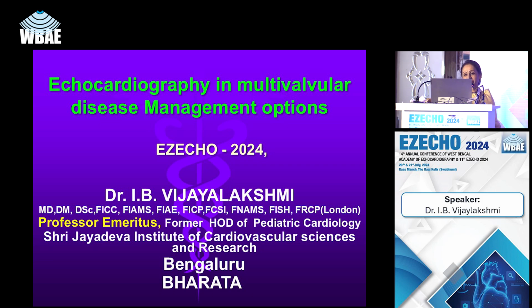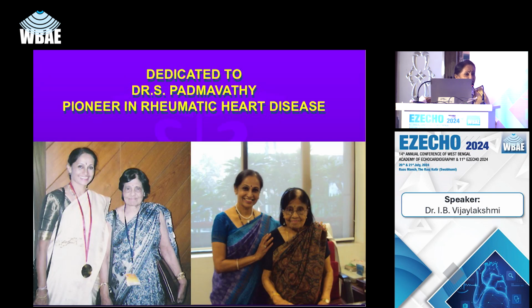And today I'm going to discuss echocardiography in multivalvular disease management options. I would like to dedicate it to my mentor and a great legend, Dr. Padmavati. The two pictures are 30 years apart.